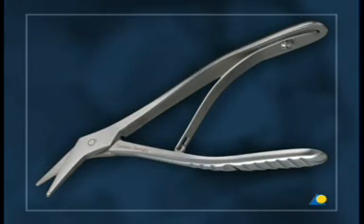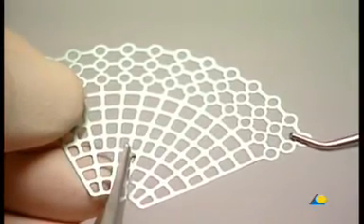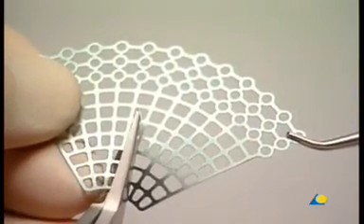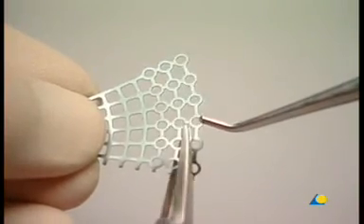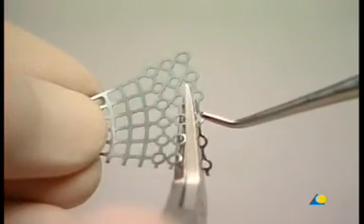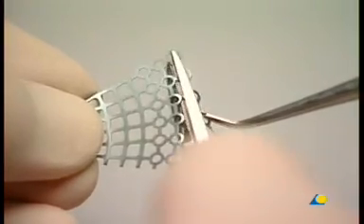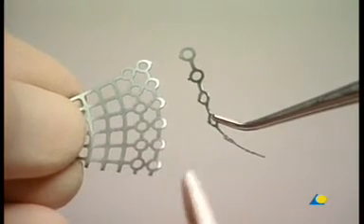The cutter for strut and mesh plates is needed. The radial design of the plate fits the conical shape of the orbit and can be cut to size. The orbital floor mesh plate is designed to allow fixation to the orbital rim. If an orbital rim plate has already been placed, the mesh plate can be cut accordingly.